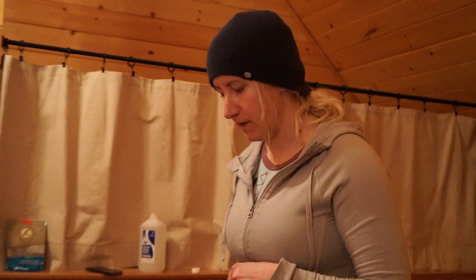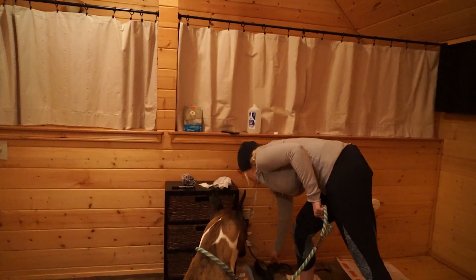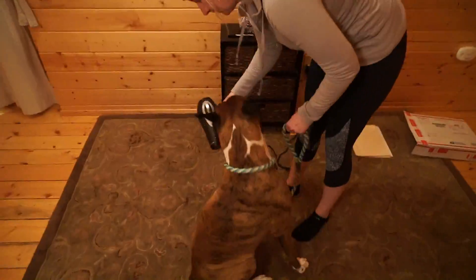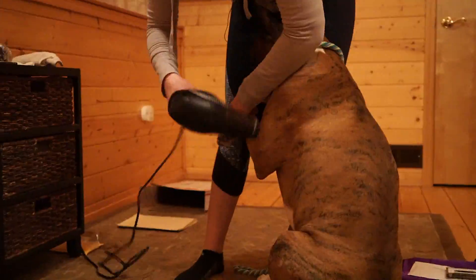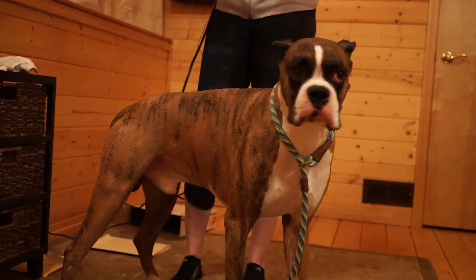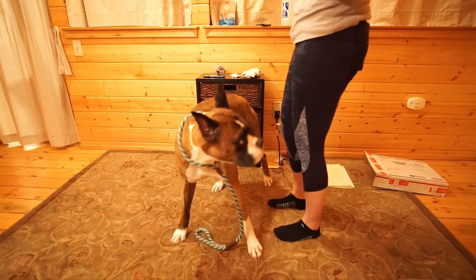I want to make sure that Putu's coat is dry before attaching the electrodes, so I'm just going to hit him quickly with the hairdryer. All done? Good boy!